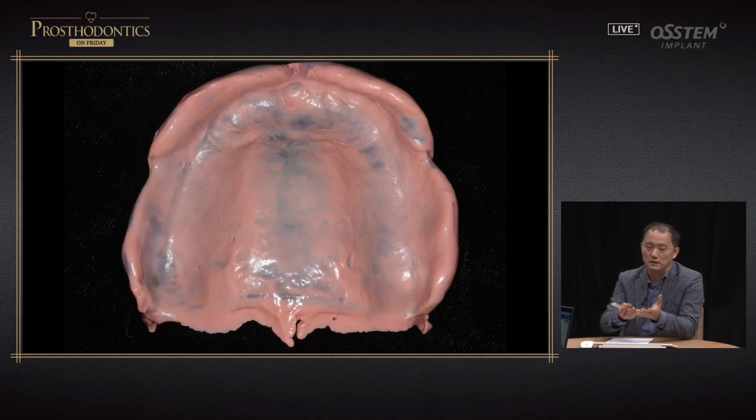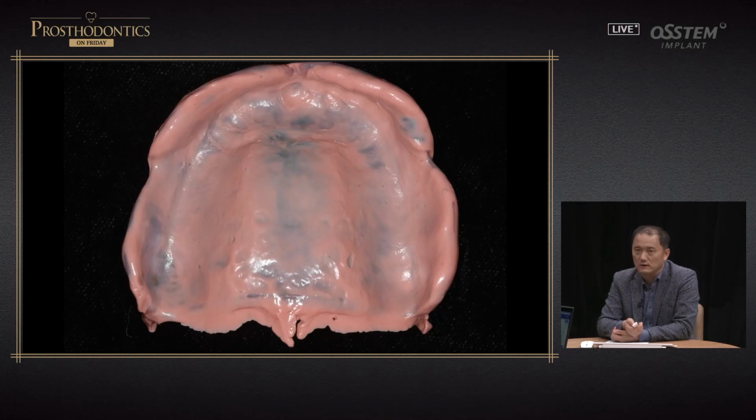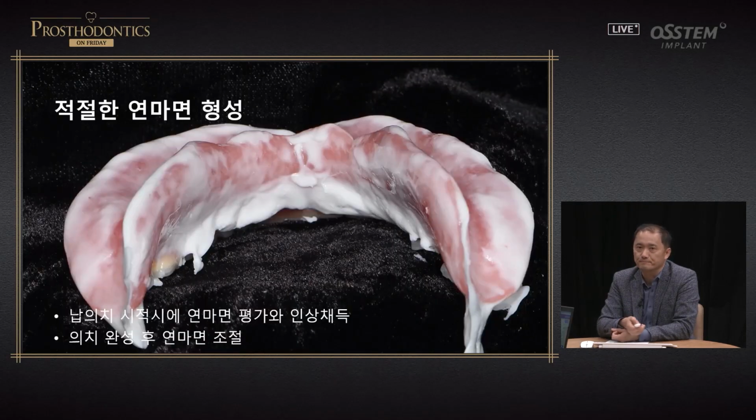Now on the maxilla side, in the denture delivery step, just before you deliver it to the mouth, the full denture sometimes comes off. There may have been a fault in the plastic, or something wrong by the technician in the lab, so it's not really adhesive. This sometimes happens, so don't be embarrassed. Use the fit checker and other things to check adequacy, and take an impression again to recover retention.